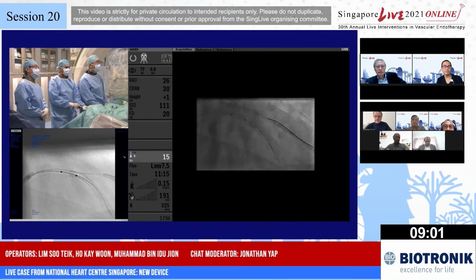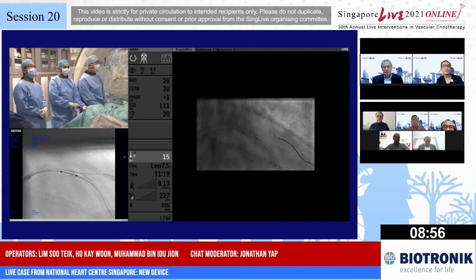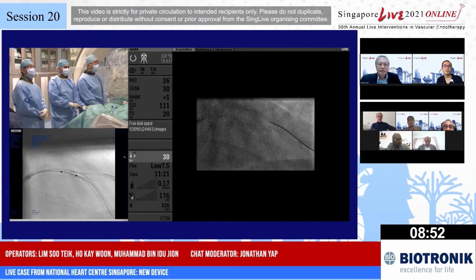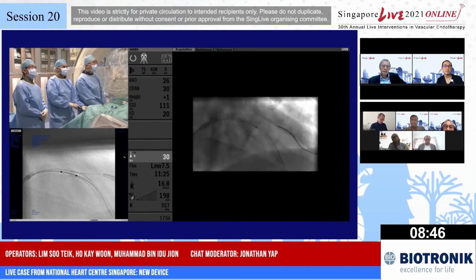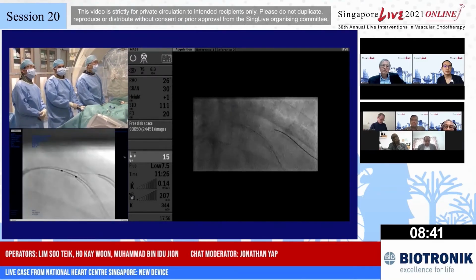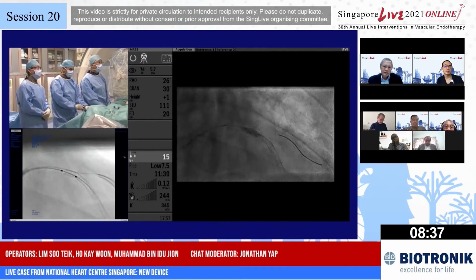It's a little bit far out still. We don't have anything shorter than that. Unfortunately, the shortest balloon is actually 8 millimeter. Okay, there's this one. I will just go in a little bit and then we go. Let's go up here. Just 12.